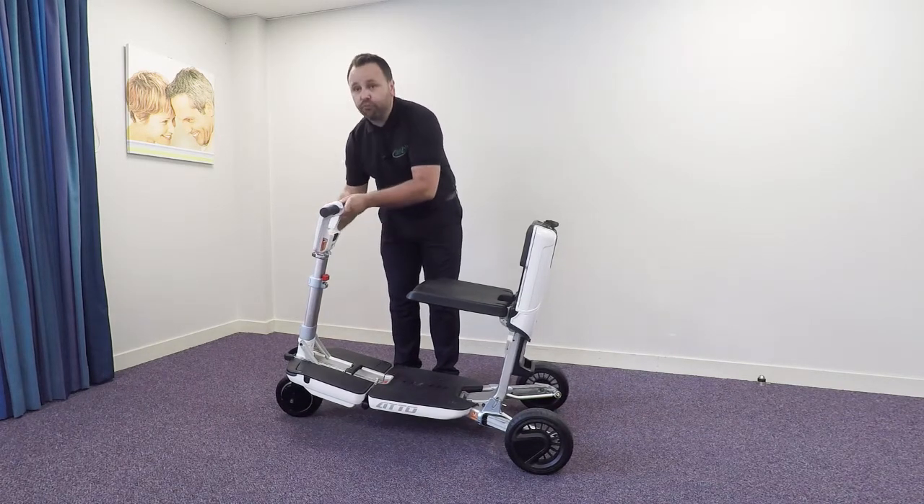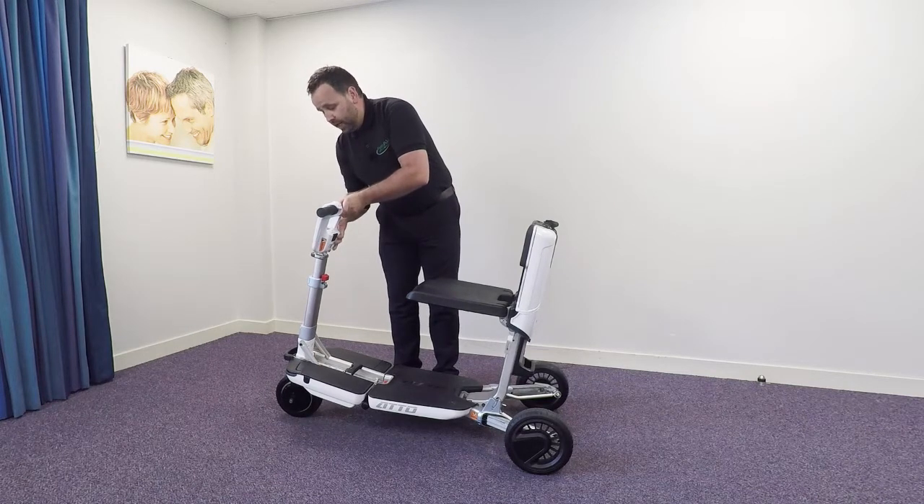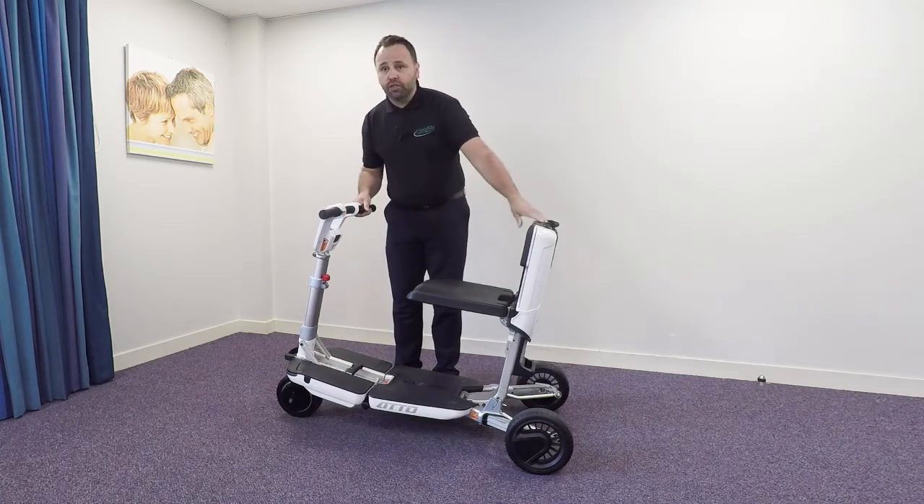The scooter's got a range of ten miles and it's operated by a lithium-ion battery which takes four hours to charge.